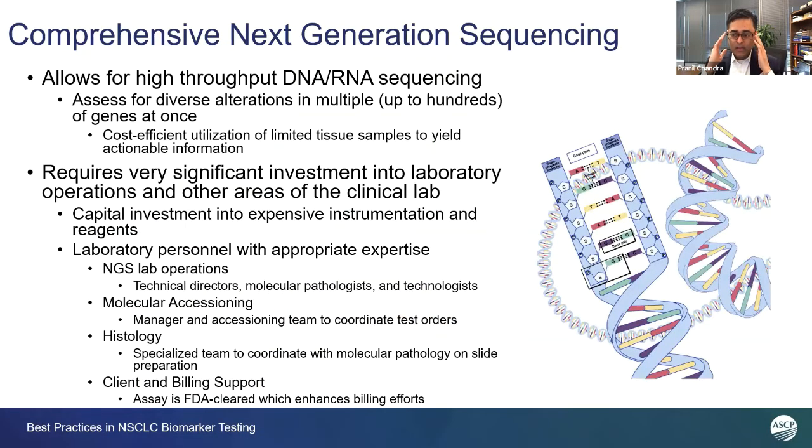And so as Dr. Vanderlyn was alluding to, wherever possible, it's important to try to implement comprehensive next generation sequencing. Now, understandably, this cannot be done at many laboratories and requires volume and an appropriate business case. So there's always the option to send out testing to an appropriate laboratory. So I'm going to just give you our perspectives as a molecular reference laboratory and some of the reasons why we went down the route of comprehensive next generation sequencing.